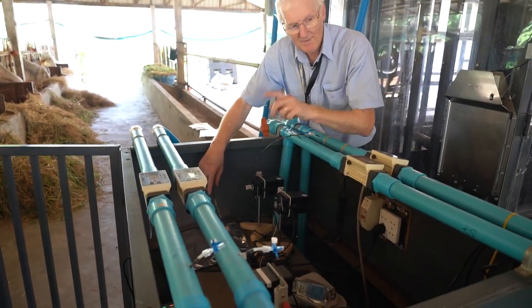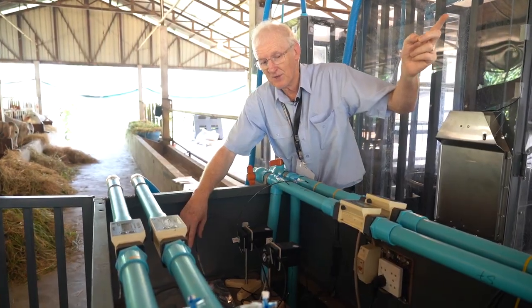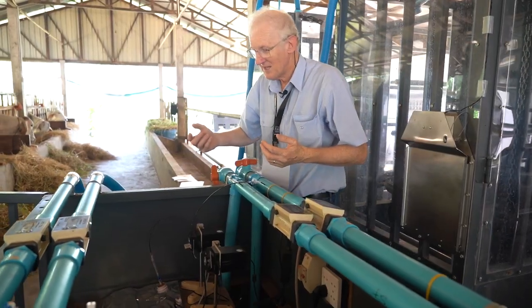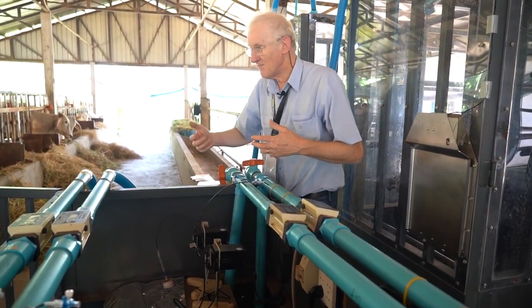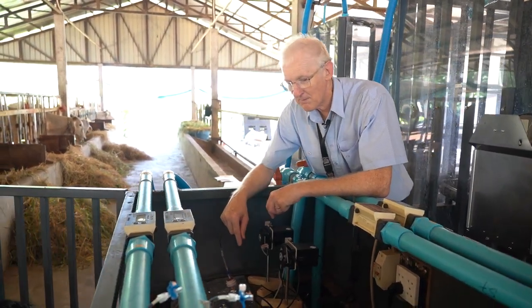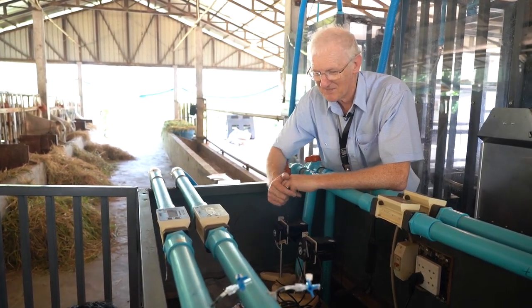So we have our air intake and stocking filter at the top. We have our flow meter. We have our sampling port. The only thing we've not explained to you is where is the fan that is pulling the gas through. And maybe Dr. Sath, you could just point out down the bottom of this trolley where the pump is that is drawing the air. It doesn't matter which one you pick, they're all the same.